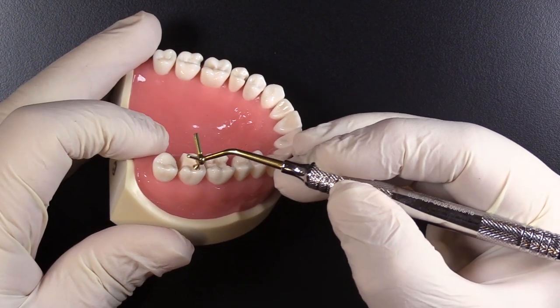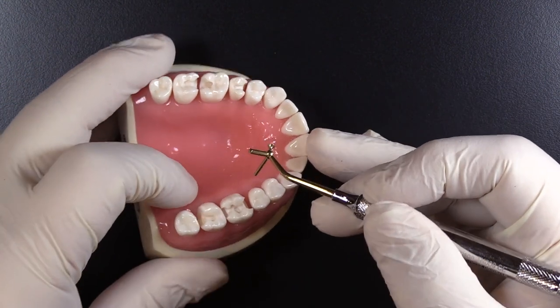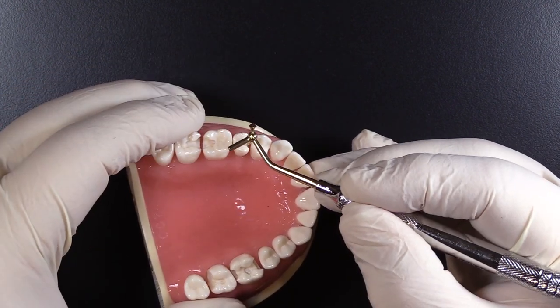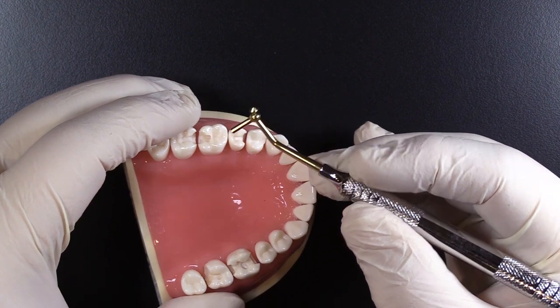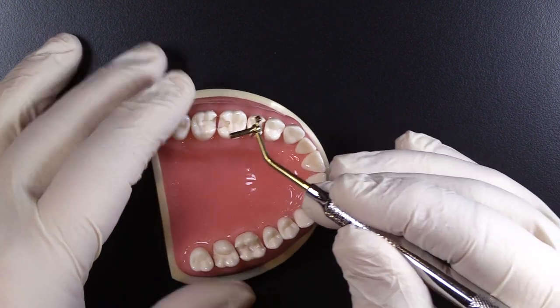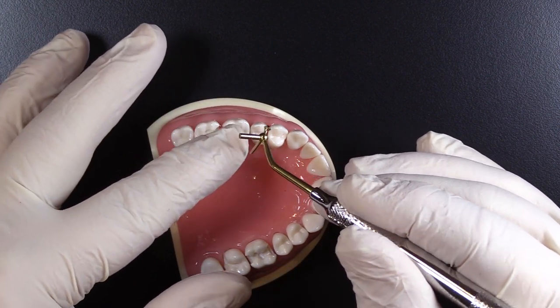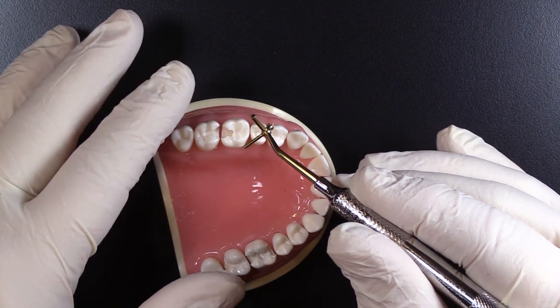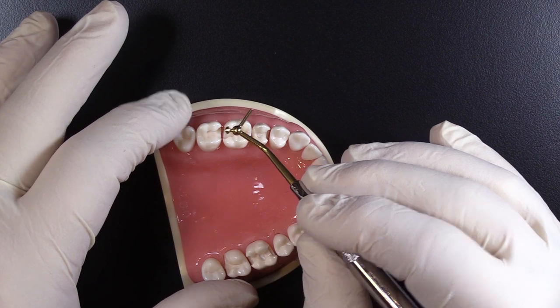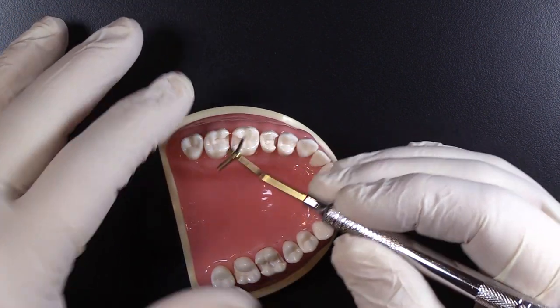The beautifully shaped acorn carver puts those occlusal grooves in there. The two sizes of condenser are perfectly situated for either small or larger restorations to compress that composite in. The ends are not quite perfectly flat — they're just a little round to help avoid creating little compression cavities with sharp edges on them. So very nice that way.